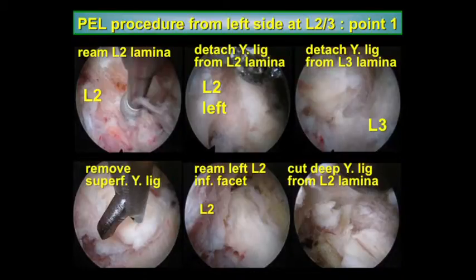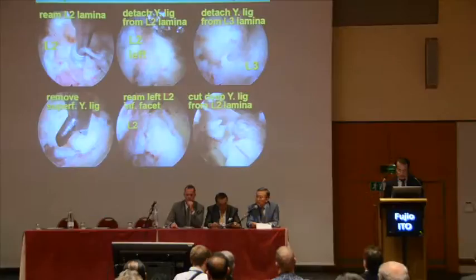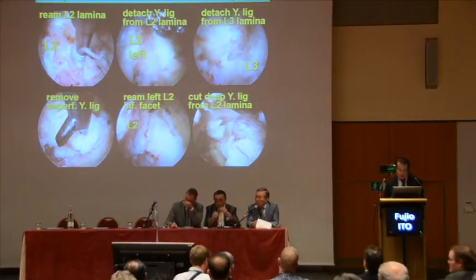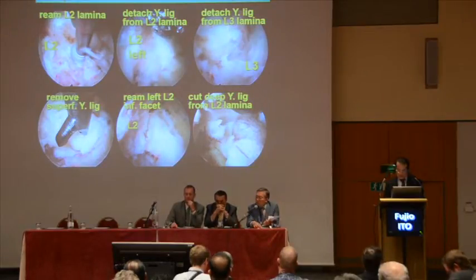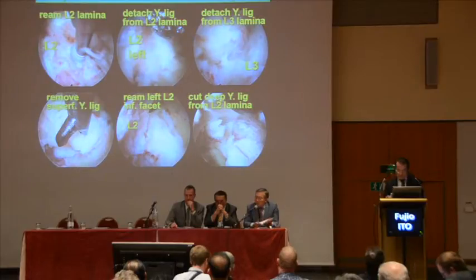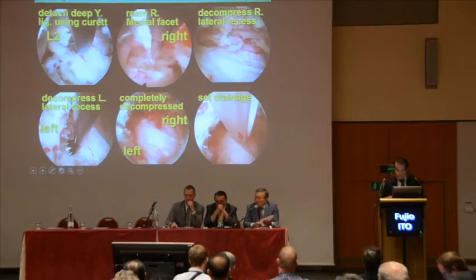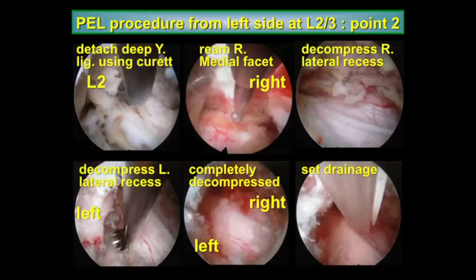These are PEL procedure points of the unilateral approach at L2-3. First, trim the L2 lamina's lower surface with a diamond burr under the endoscope. Then detach the yellow ligament from it. Do the same at the L3 lamina. Remove the superficial yellow ligament with a punch. Trim the left L2 inferior facet. Cut the deep ligament from the L2 lamina. From there, detach the deep ligament at L2 using a curette.